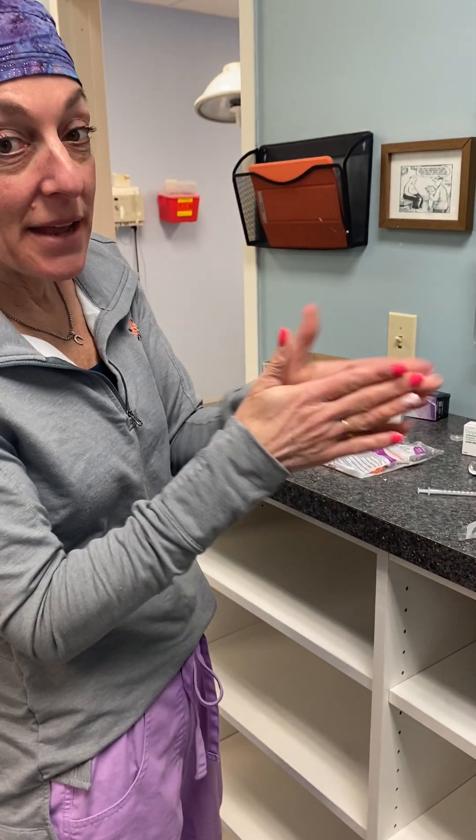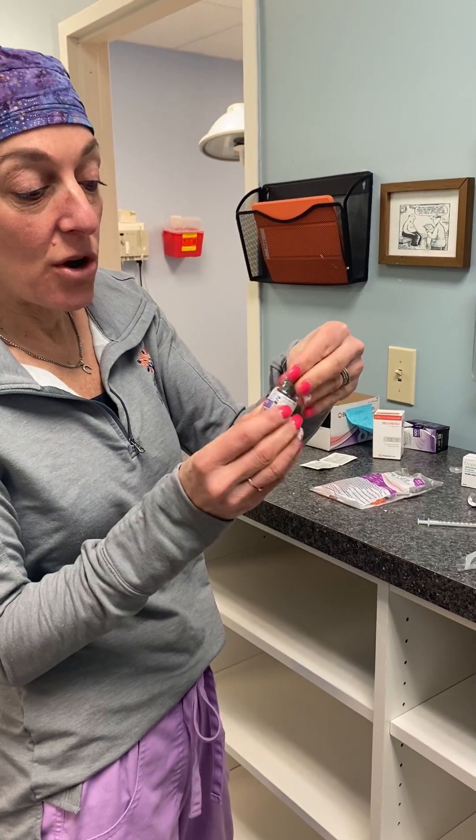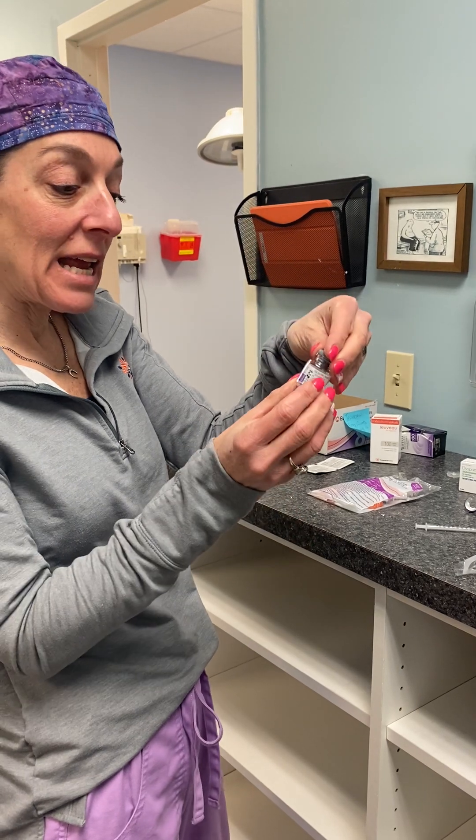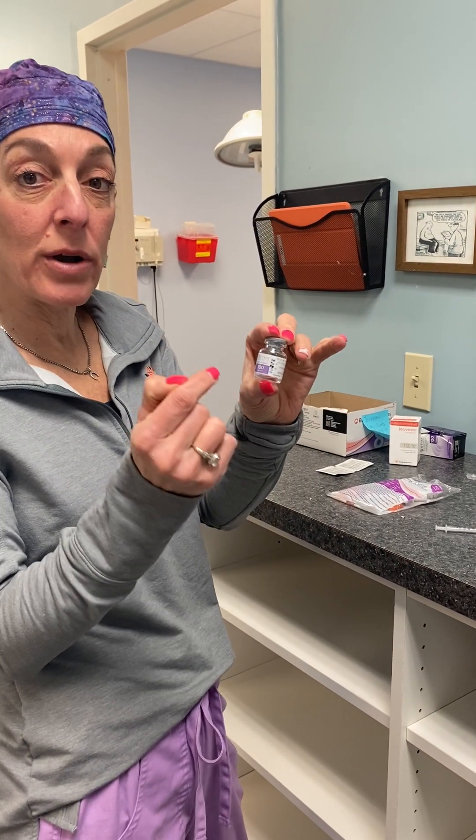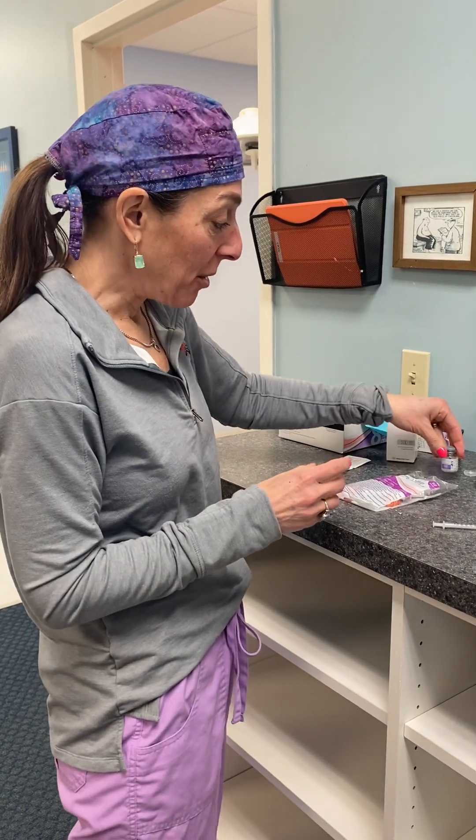Now that is ready to inject. In that one cc you now have 100 units of Botox.